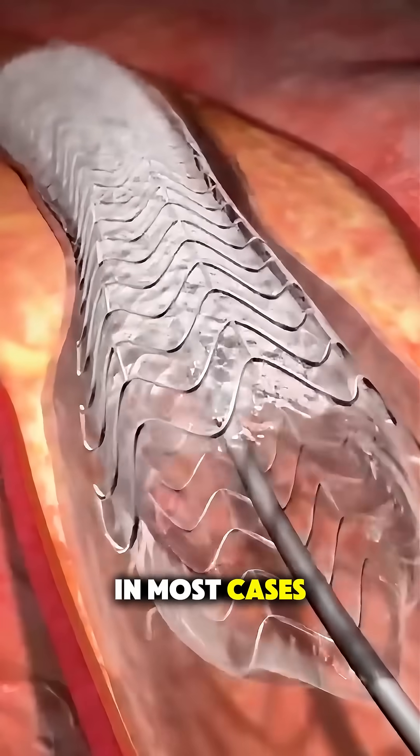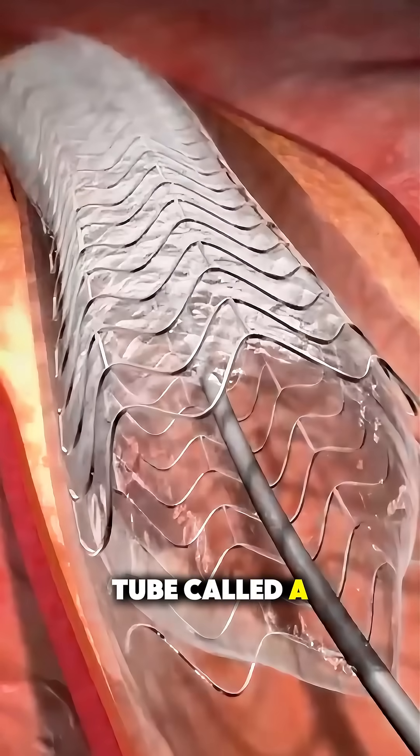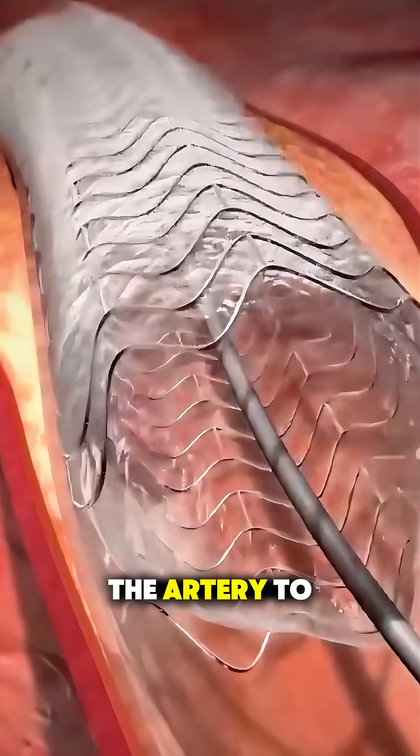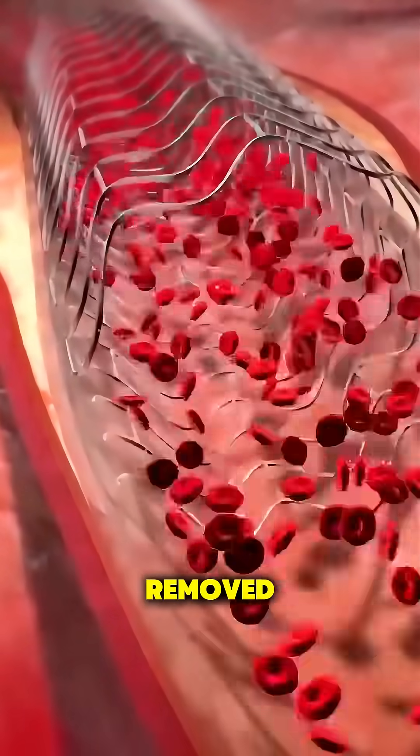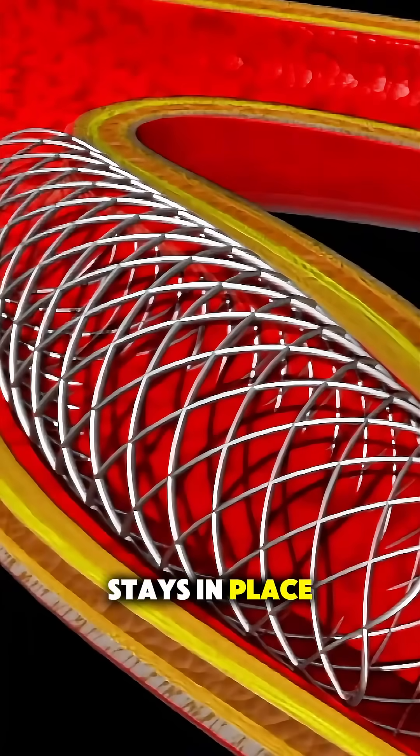In most cases, a small mesh tube called a stent is placed in the artery to keep it open long term. The balloon is then deflated and removed, but the stent stays in place permanently.